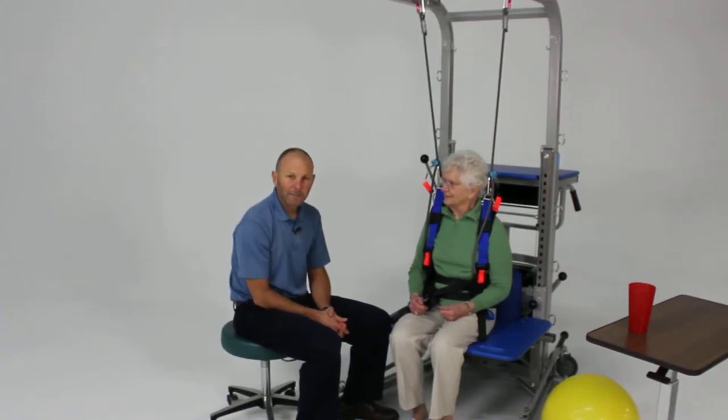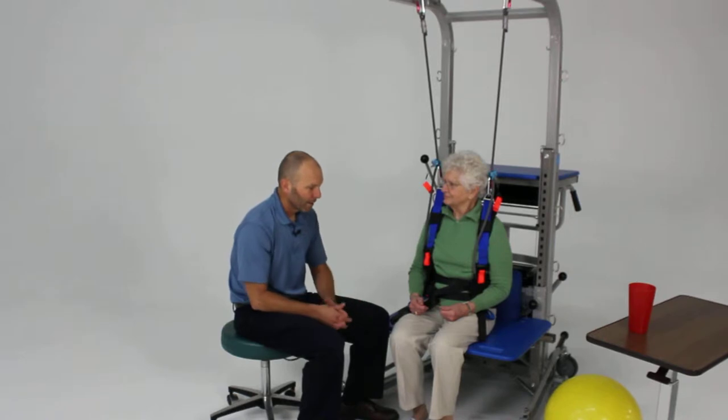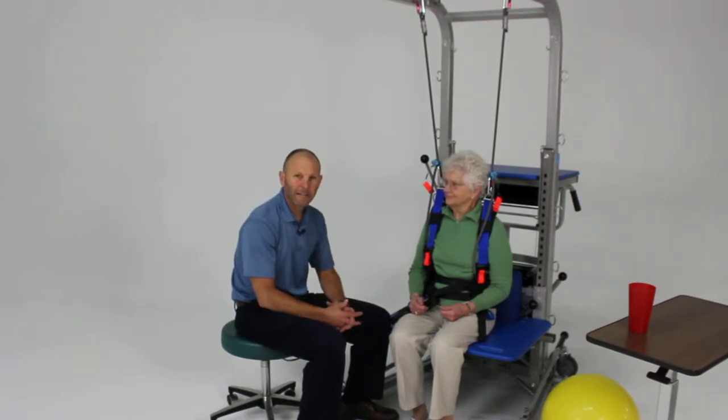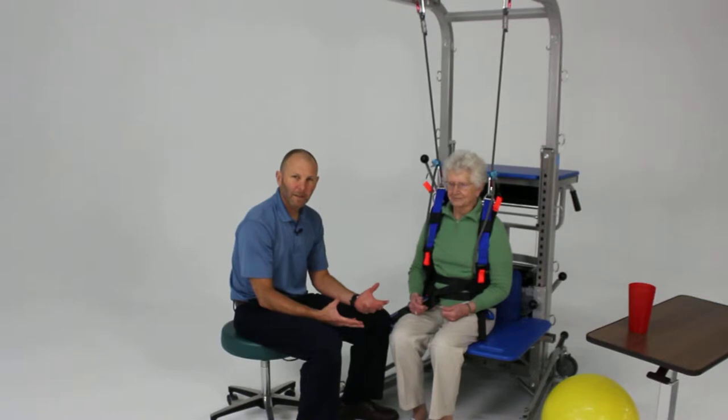The rehab station is an excellent tool for working on a variety of levels of balance activities. From the most basic level of balance activities is just working in a sitting position.